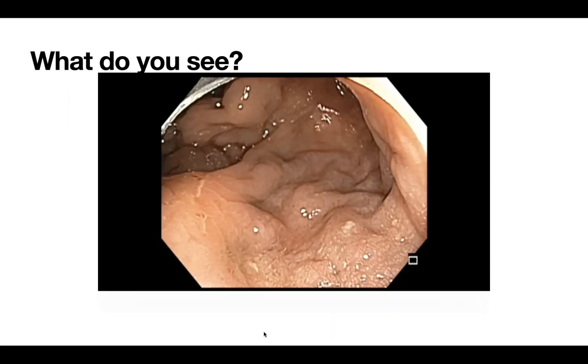It is possible that this part, originally the polyp, must have been flat like the proximal part, and because of its close proximity to the anus, there must be some amount of mucosal prolapse that is causing this kind of additional traction on the mucosal surface and the irregularity. I think the key is retroversion and injection to see whether it lifts. Right. Yeah, you're right. So I think, Sriram, you make a very important, good point here. Whether the mucosa is just a little bit edematous. It doesn't look like an adenoma type of mucosal pit pattern.